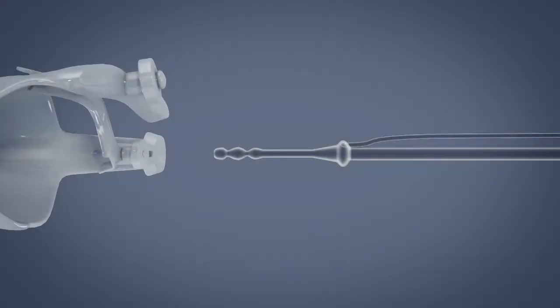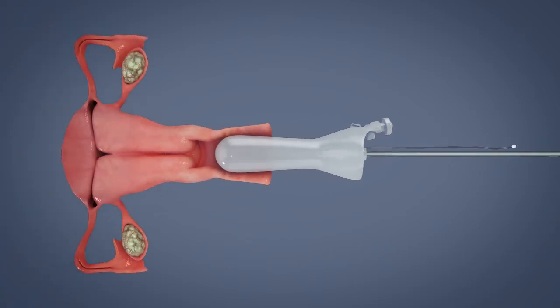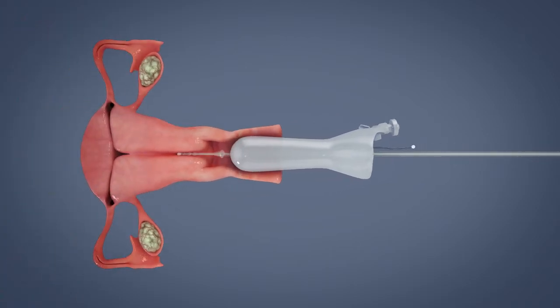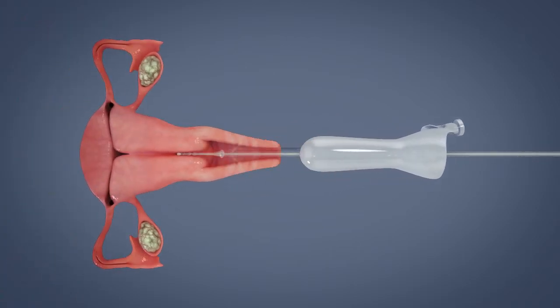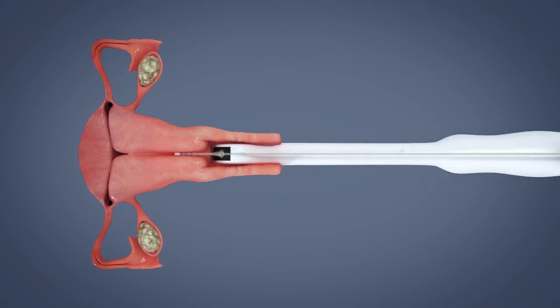By gently filling the catheter with gel foam, allow the air to escape from the catheter before introduction. Gently introduce the catheter into the cervix. Remove speculum, position the ultrasound transducer.